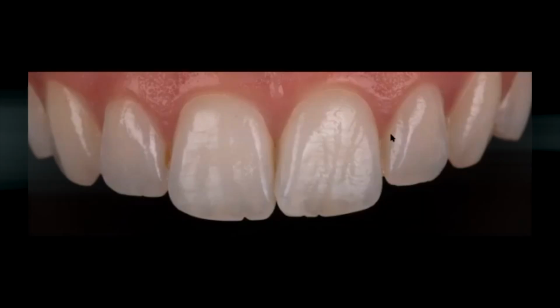We have the tendency to think that when we just add some white colors, like a translucent white composite, it will just increase the value, but it's not true. We can just have a very dark, very grayish color with a B1 or with a bleach color because it does not have enough brightness. Why? Because it's too translucent a material.